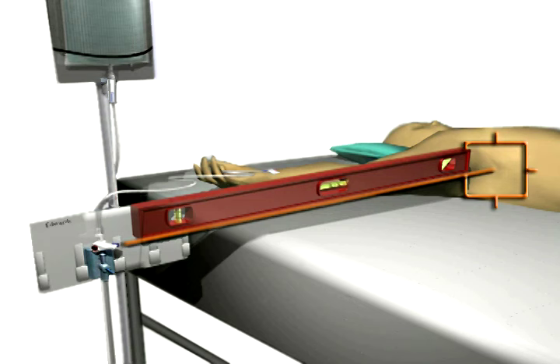Step 2: for intravascular pressure monitoring, level the transducer to the patient's phlebostatic axis, which can be found at the midpoint between the anterior and posterior chest wall at the fourth intercostal space. Note it's important to maintain the level of the transducer with the phlebostatic axis at all times while monitoring to ensure accurate pressure readings.